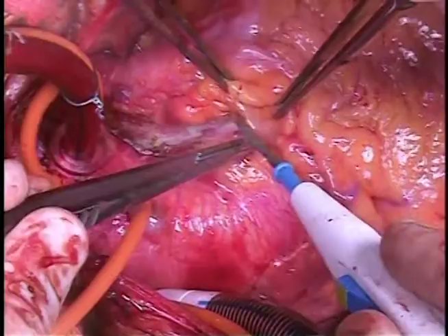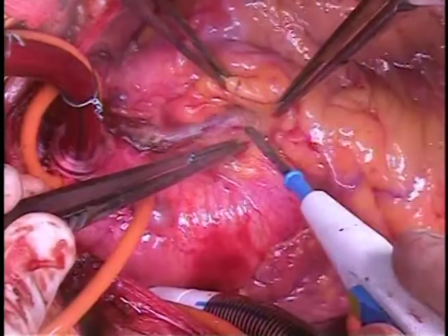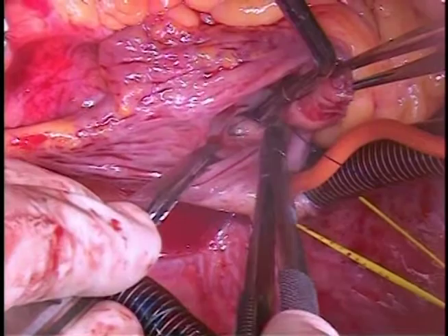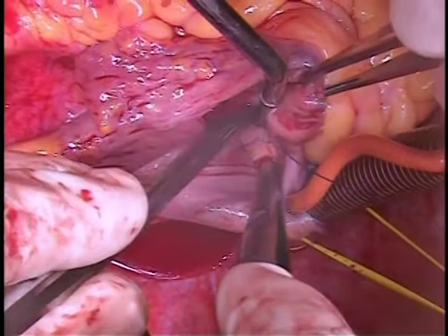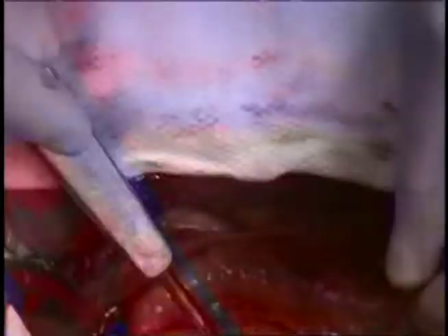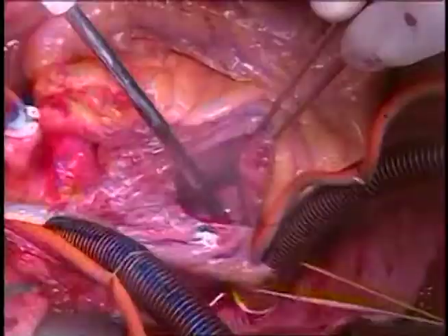The procedure begins with aortic and bicaval cannulation. The aortic cannula is placed near the innominate. Once on bypass, you begin dissecting out the AP window, staying close to the pulmonary artery. We prefer bicaval cannulation so that you can place the retrograde cardioplegia directly into the proximal coronary sinus. This ensures excellent distribution of cardioplegia without worrying about protection of the RV or the LV.